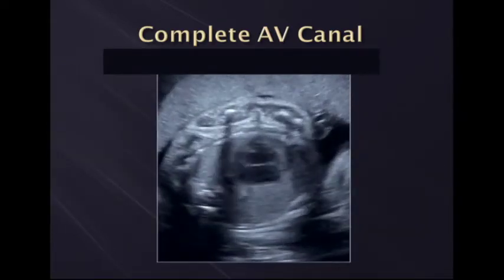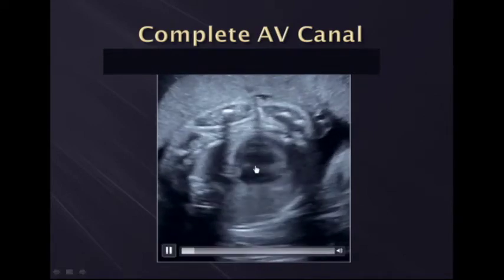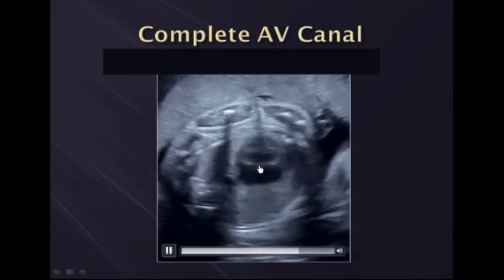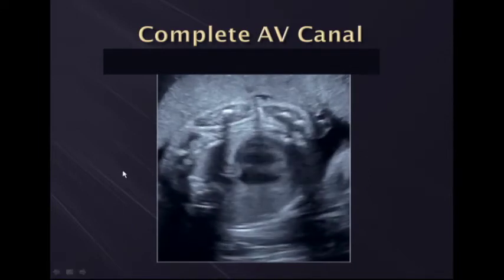You can see it very nicely here, this large AV canal in real time. You can watch closely as the two valves come together, almost form that T configuration where they actually touch together.